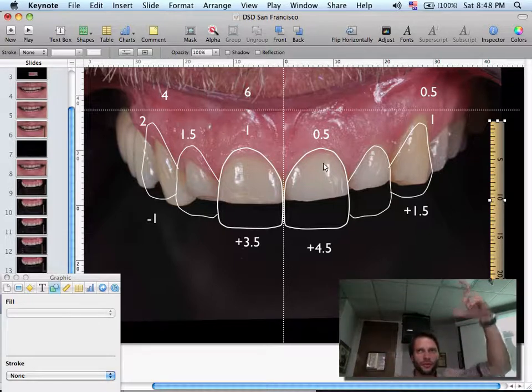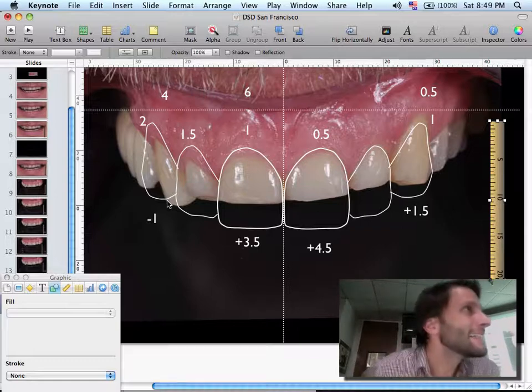and trim the bone to that new position. And then the additions here on the wax, what I do is with the caliper I will add wax, and with the caliper I will make sure I'm adding exactly the amount that I'm seeing here on the wax-up, so I have the same kind of lengthening on the wax-up that I do here. When I have to reduce, it's easier. I just mark the model and I grind down the stone at that level. Okay? You make a reduction guide first, just for later use.